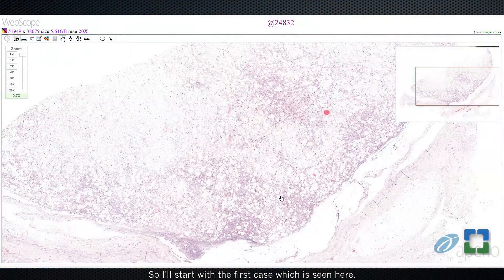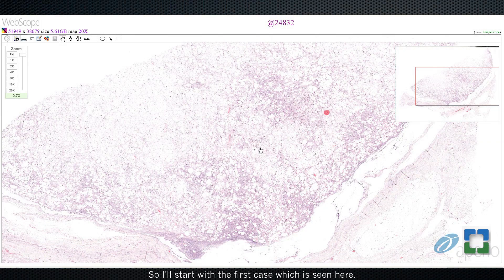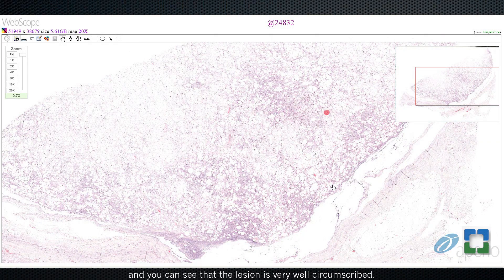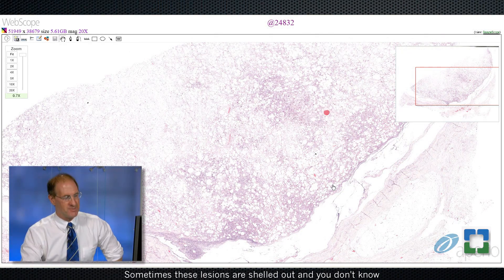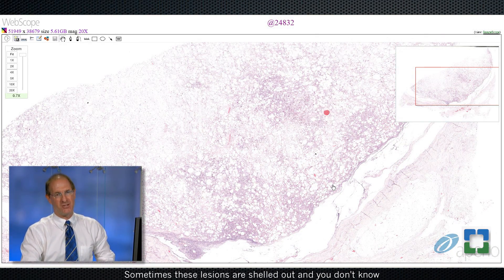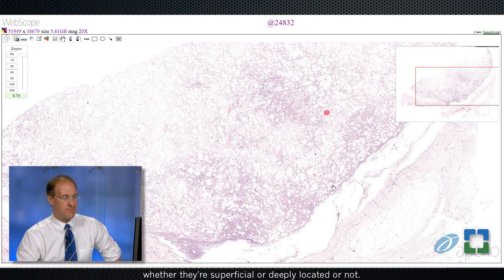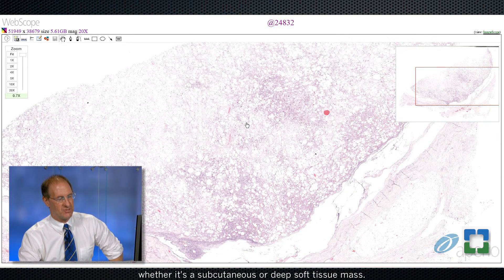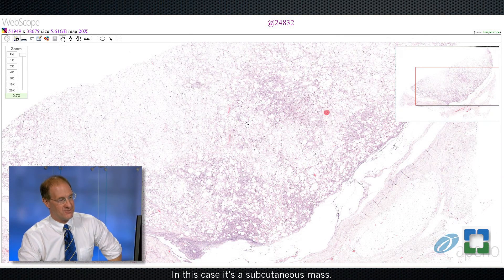I'll start with the first case, seen here. This comes from a 49-year-old male who had an upper back mass, and you can see that the lesion is very well circumscribed. Sometimes these lesions are shelled out and you don't know whether they're superficial or deeply located, so one of the things we always do is look up the MRI and determine whether it's a subcutaneous or deep soft tissue mass. In this case, it's a subcutaneous mass.